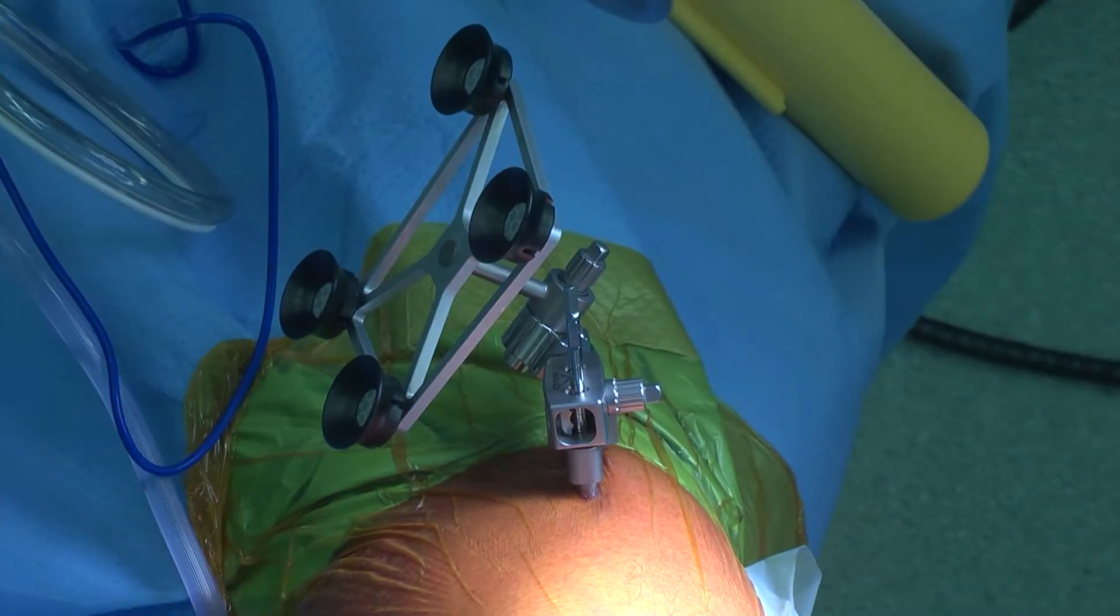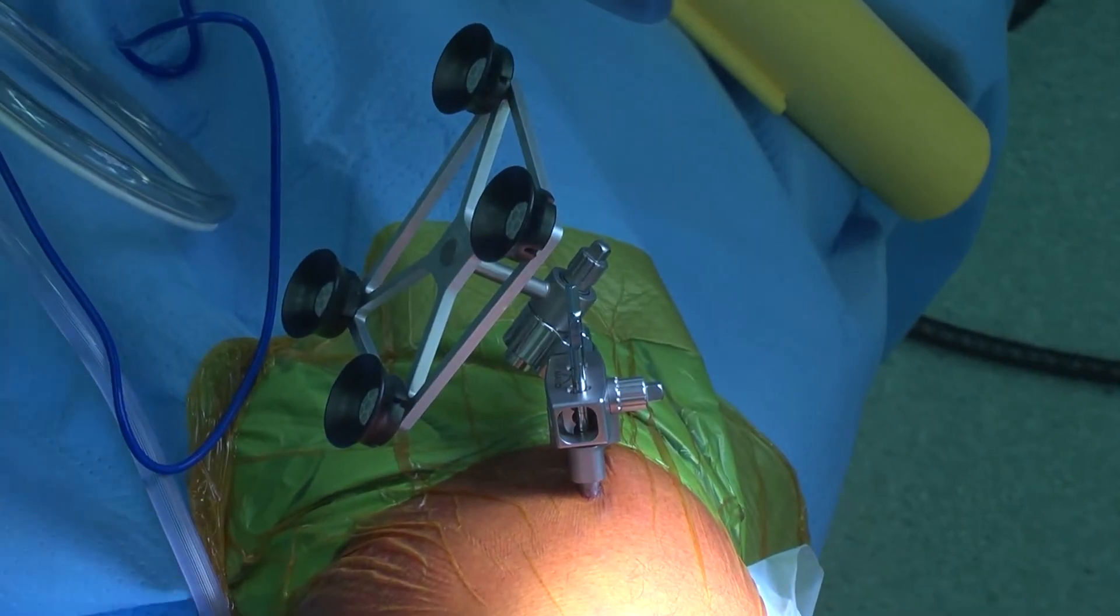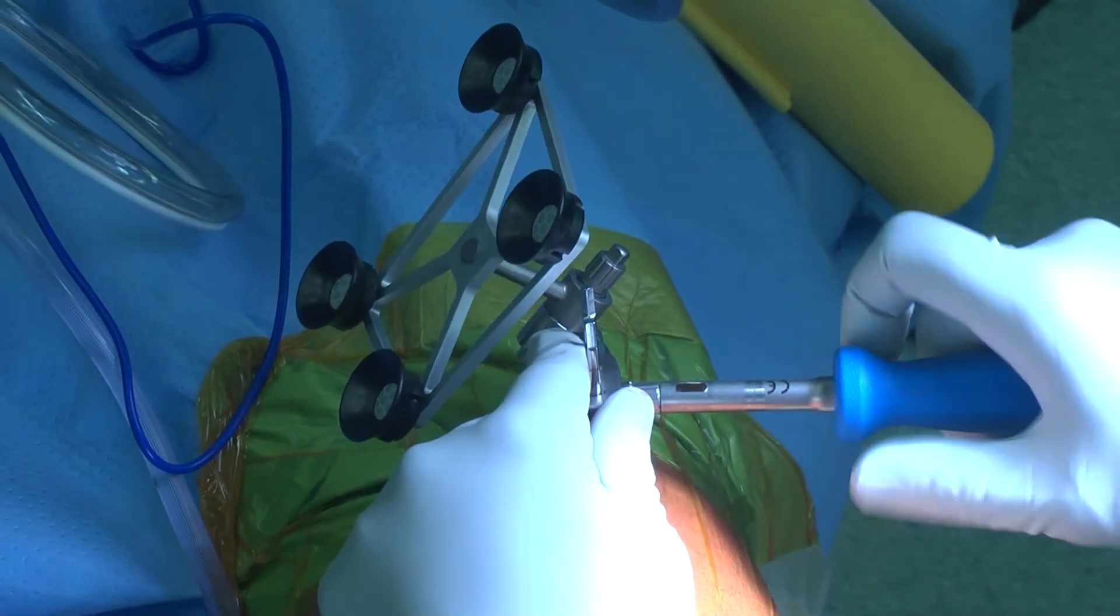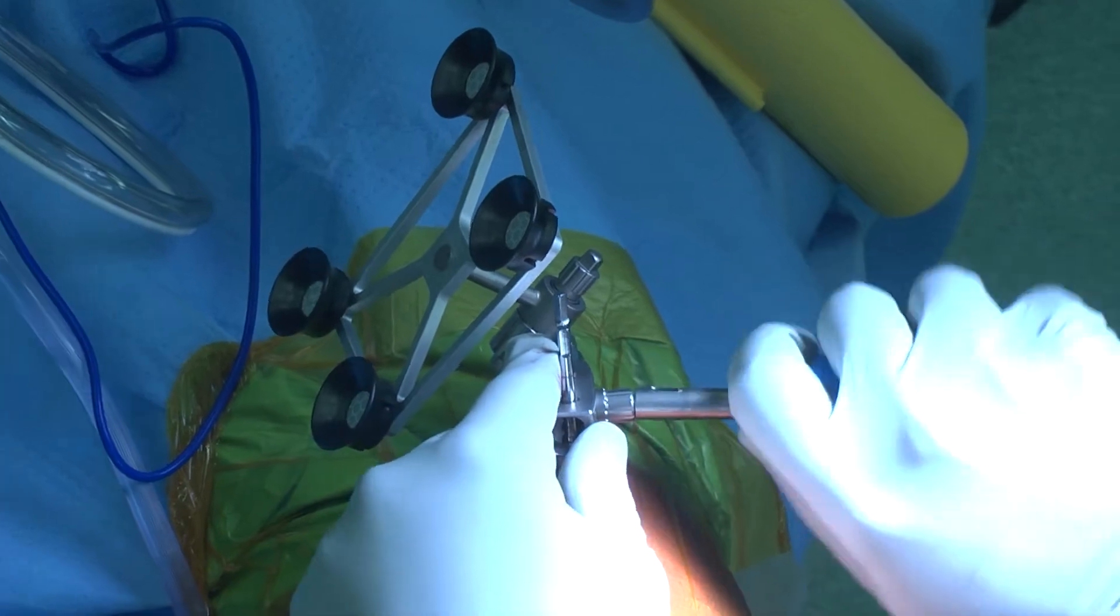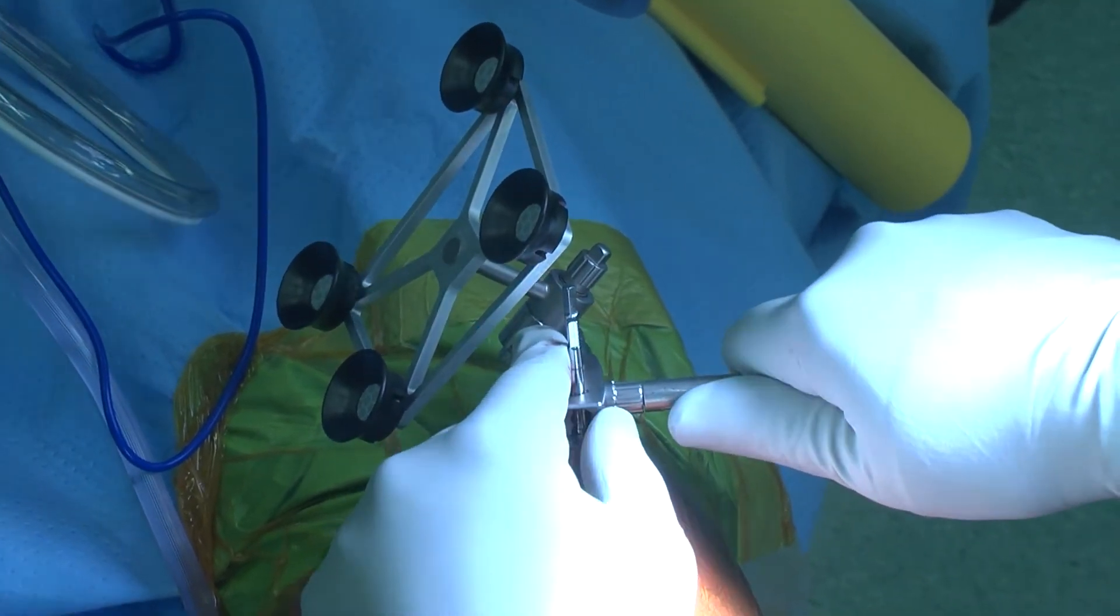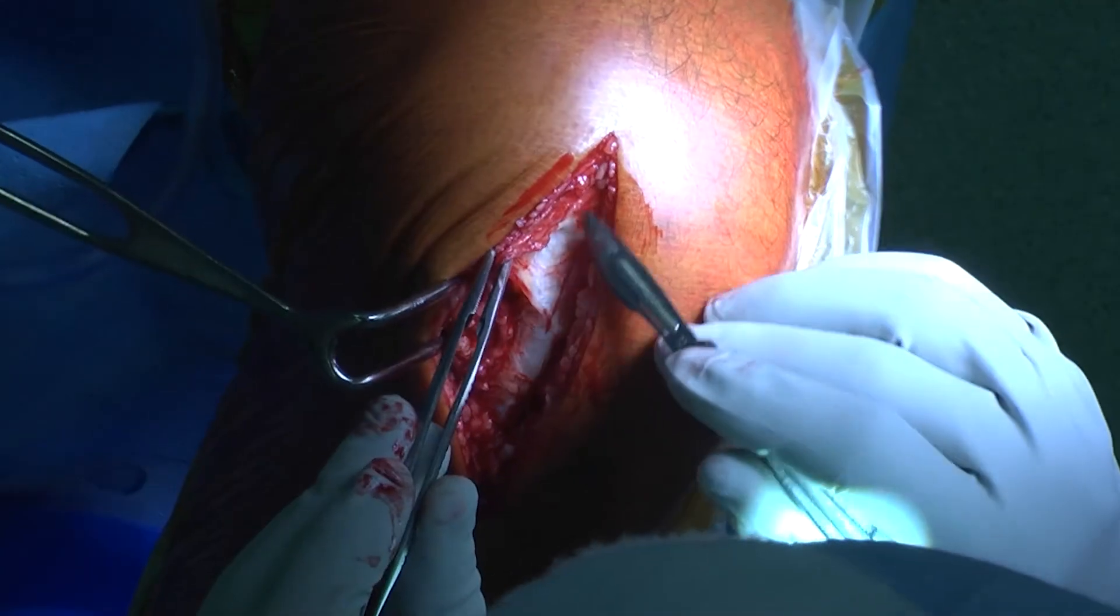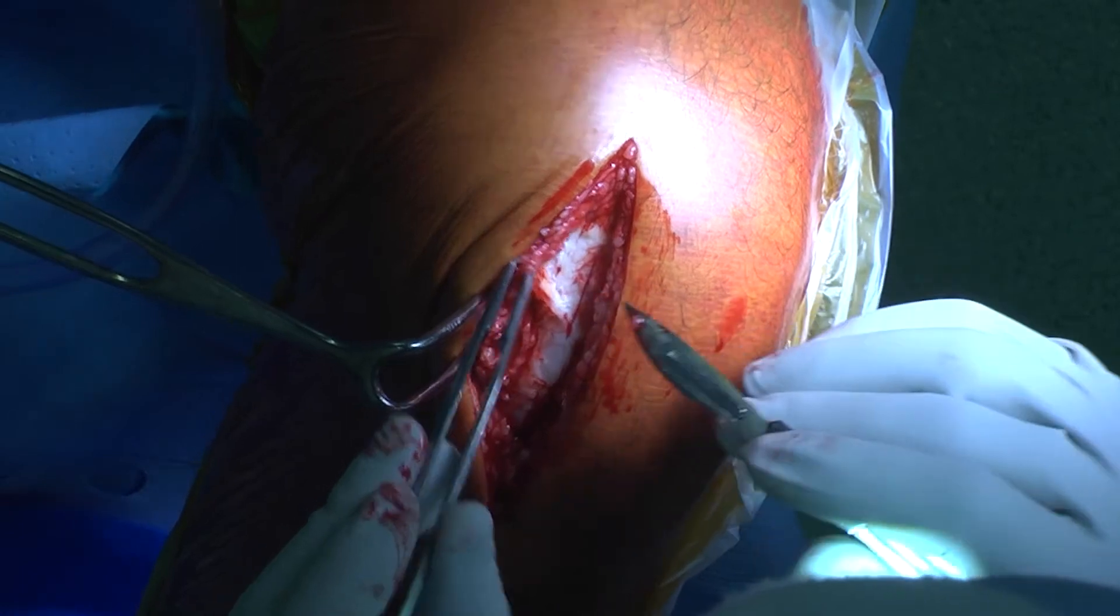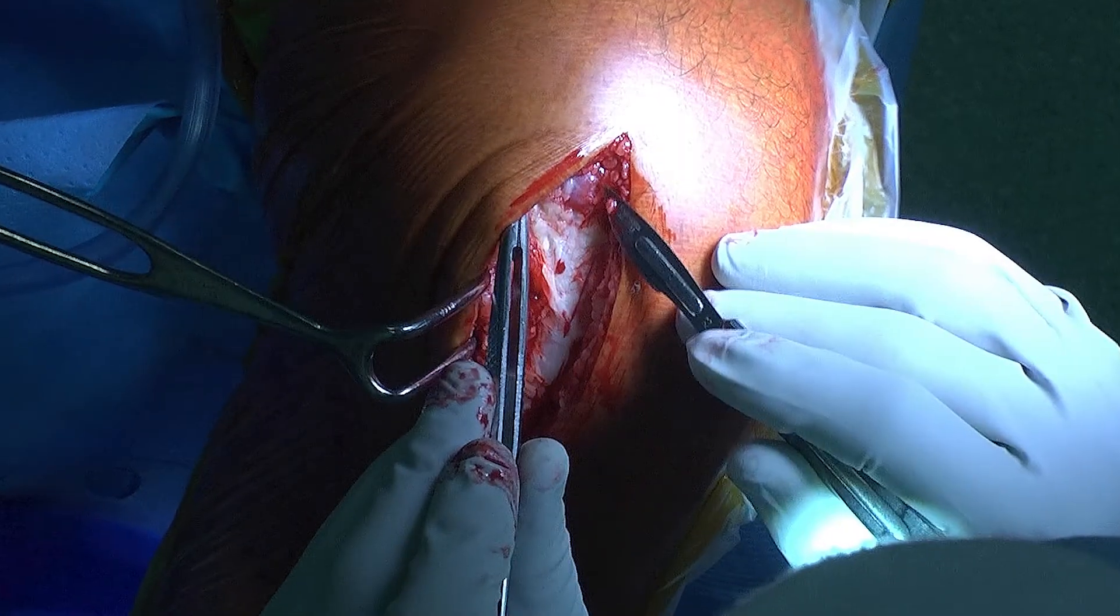The first step of the operation is to insert pins into the femur and tibia, which allow for fixation and stabilization of the trackers that communicate with the robot and the computer.